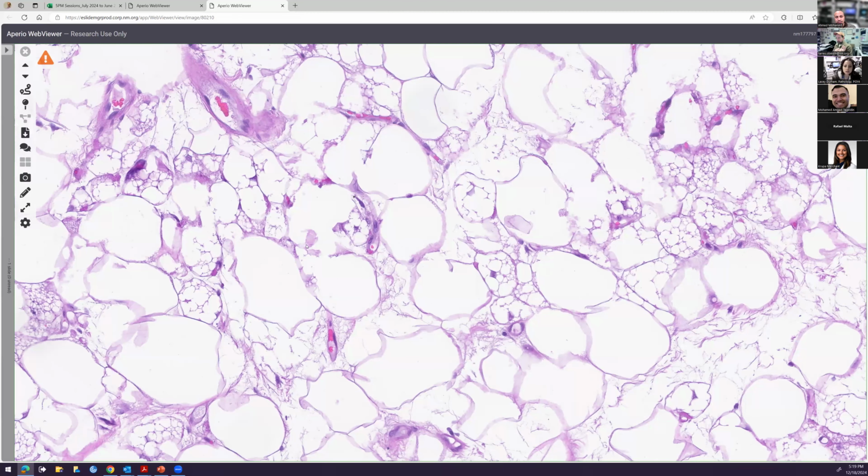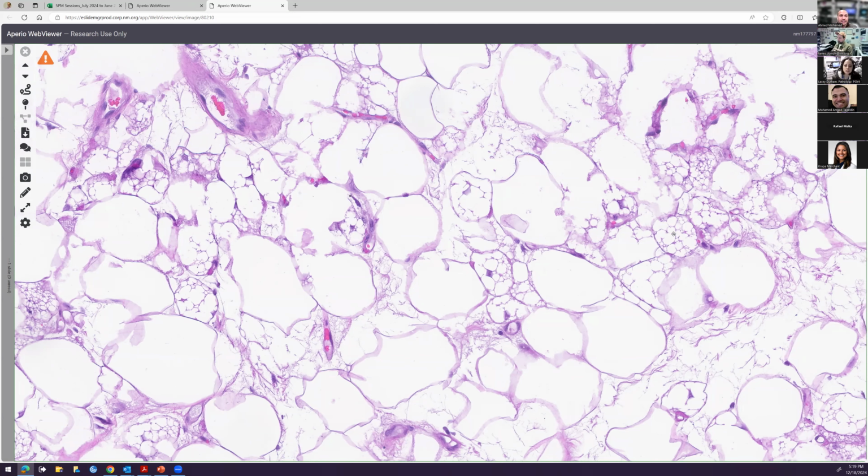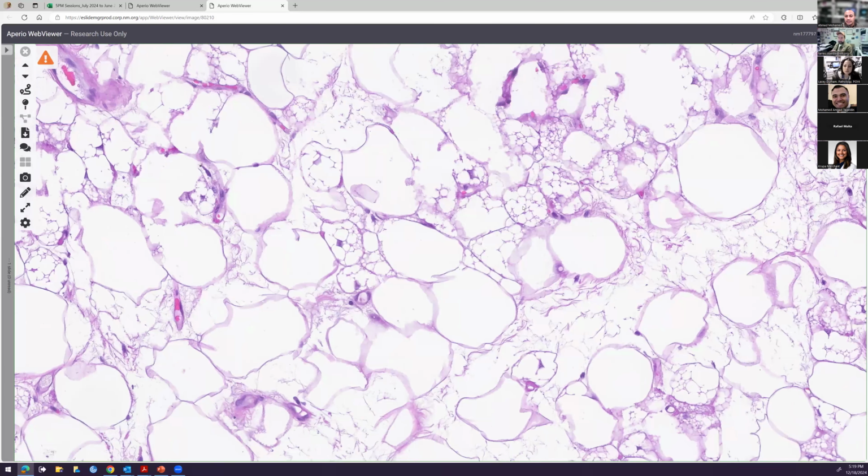But if you think about it in the context of more bubbly, or foamy, or microvesicular, almost like microsteatosis, for example. Similar idea, right? So think of these as little, small, rounded, punctate spaces within the cells. What are these cells? What exactly what kind of tissue is this?